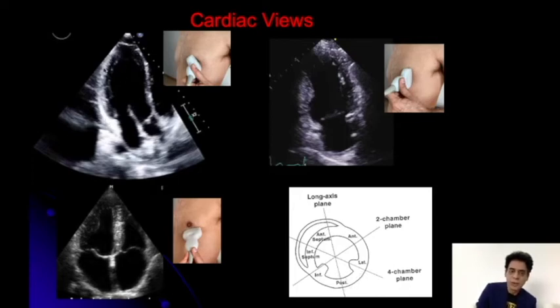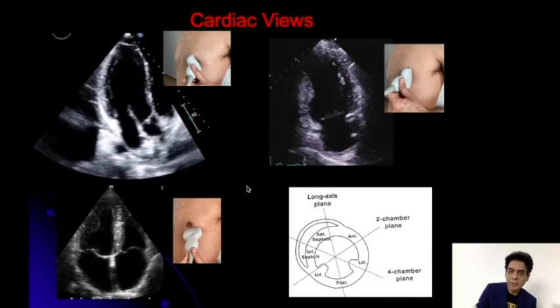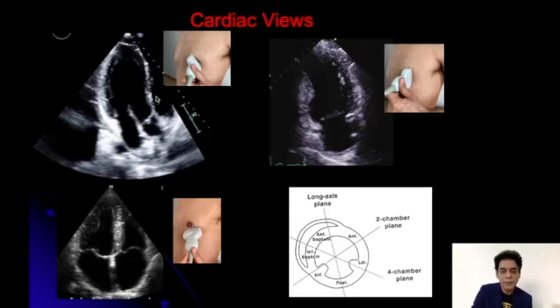So this is the posterior inferior or inferior lateral wall. We were keeping the probe oblique transverse and facing towards the right side. Now we have kept it oblique longitudinally, again facing it towards the right side, and we get this apical long axis view.